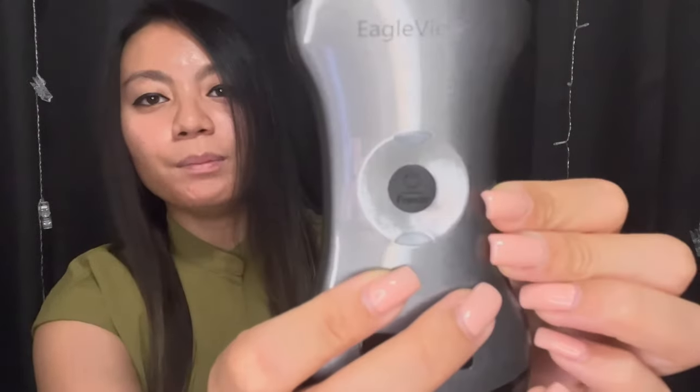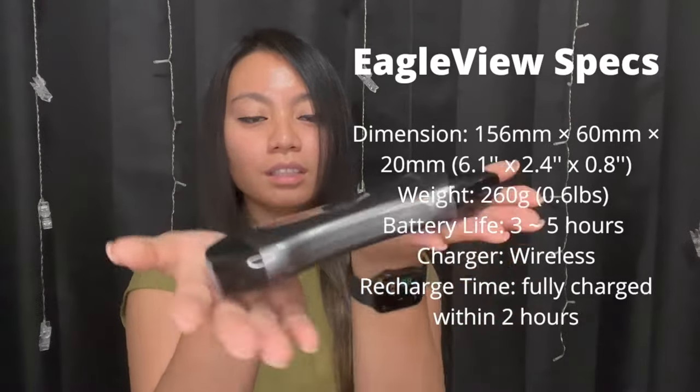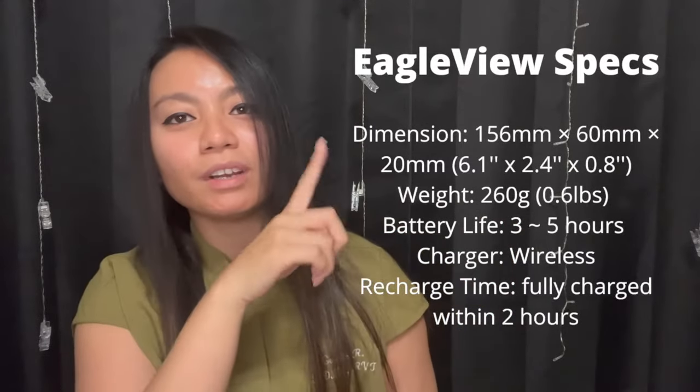To turn it on you've got this power button, and that's also going to be your freeze button. You can see the Eagle View name on the probe. What makes it stand out is that it is completely wireless — it's connected by Wi-Fi. It's very light, and I'm going to put all the specs on screen so you can see exactly how much it weighs and the dimensions of the probe.